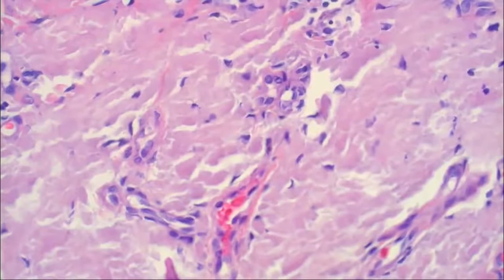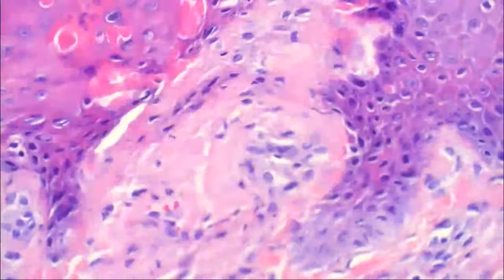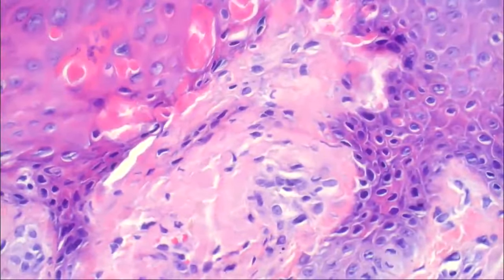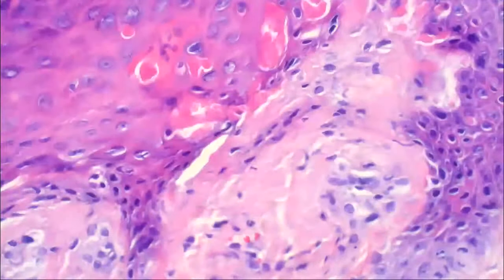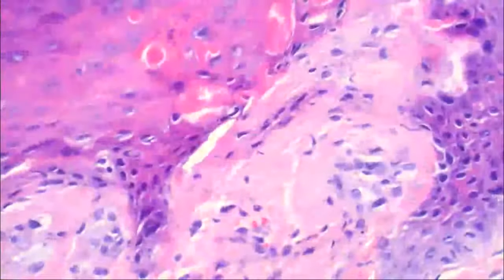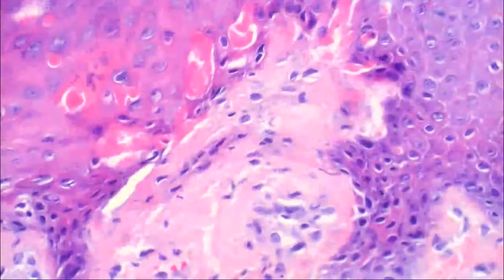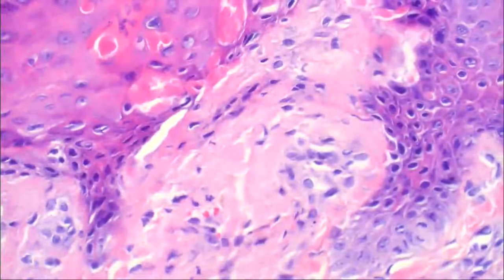Good, I'm glad. What else were you thinking it might be, though? Because the boards are not going to just have one answer for you, they're going to try to trick you. The first part, when I saw the epidermis first, and I saw all the dyskeratotic cells, I started thinking along the lines of a warty dyskeratoma and things like that, but it didn't really have acantholysis. So what's the pathophysiology of amyloid in this situation here? Should we work this guy up for multiple myeloma and do a bone marrow? So that would be hematology?